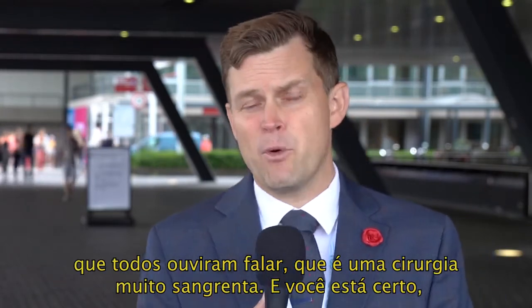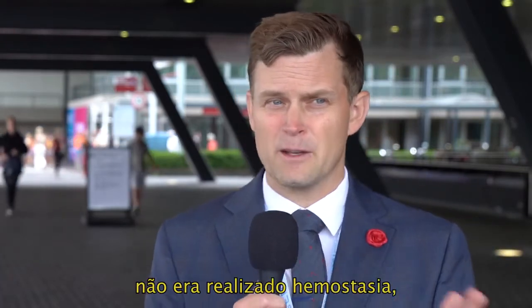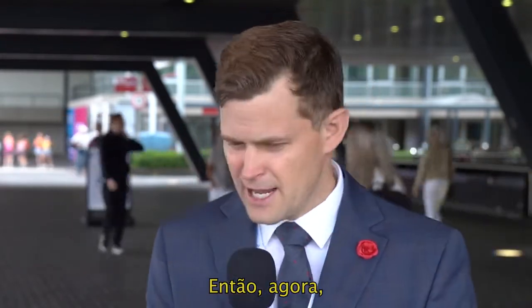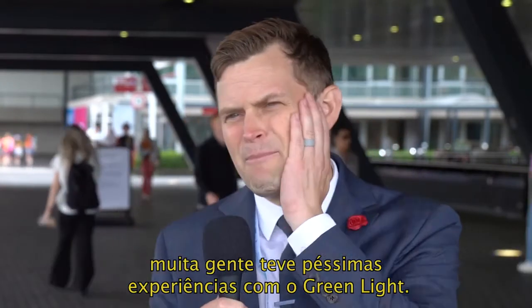You're right, because at that point in these trials, dating past 4 or 5 years ago, we were dealing with no hemostasis. It was traction control and CBI. It's different now. So today, if we were to go and say, just like green light, we do green light, and people still remember, I had that bad experience with green light.